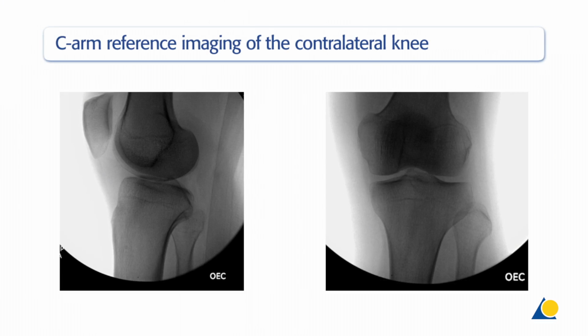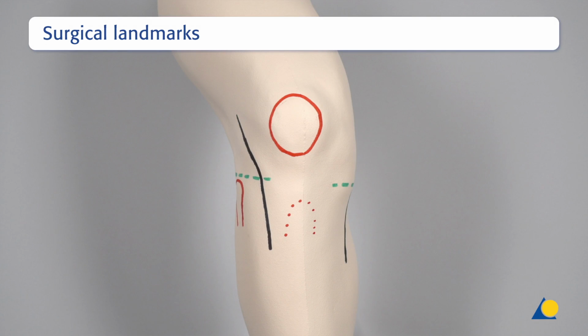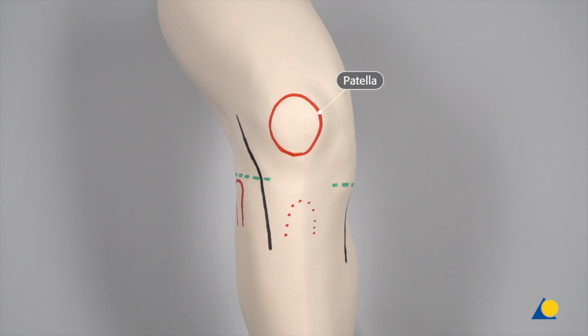Clinically, in this open reduction internal fixation ORIF procedure, C-arm reference imaging of the contralateral knee is taken for subsequent verification of the reduction. The surgical landmarks of this procedure are the patella, tibial tuberosity, fibula head, and the lateral and medial joint lines. Based on these anatomical landmarks, the planned approaches are along the medial and lateral incision lines.